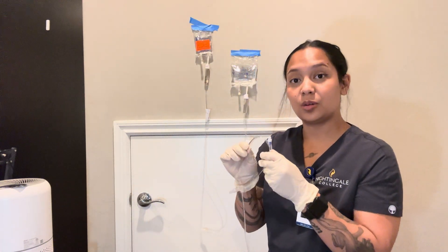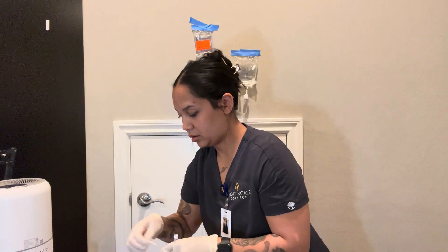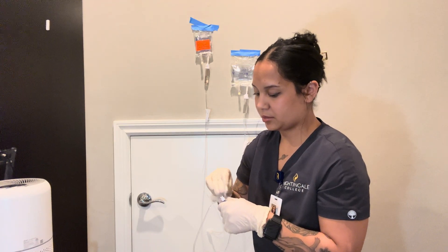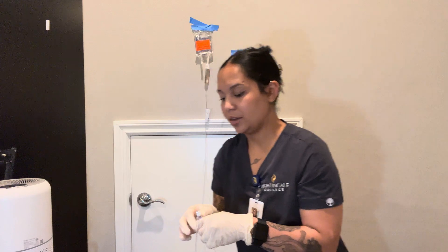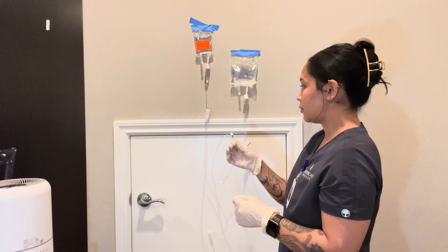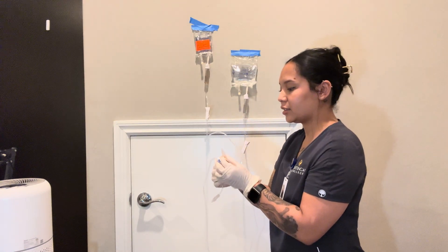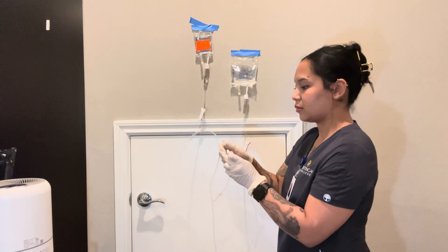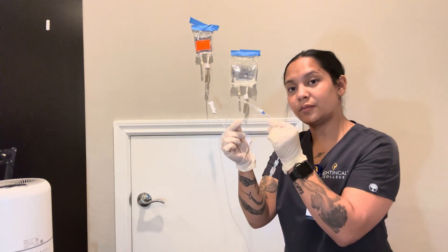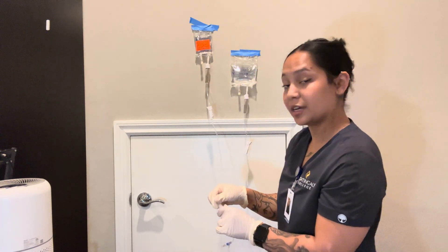I'm going to connect it to the white port here. I'm going to use the alcohol swab, let it dry for 15 seconds, and then go ahead and connect this. Now I'm going to count the 100 drops from this one and count for a full minute.